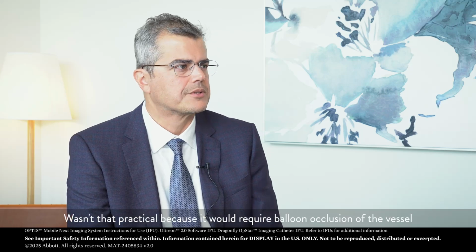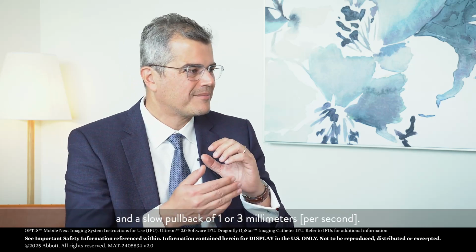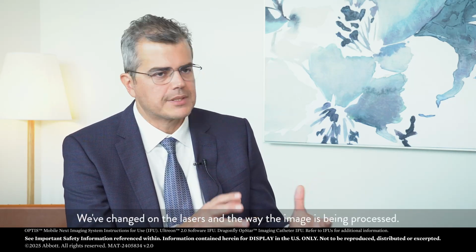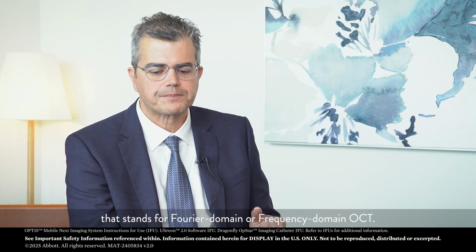It wasn't that practical because it required balloon occlusion of the vessel and a slow pullback of 1 to 3 millimeters. They call it time domain OCT. We changed the lasers and the way the imaging is processed, and we got to a generation of FD-OCT, which stands for Fourier domain or frequency domain OCT.